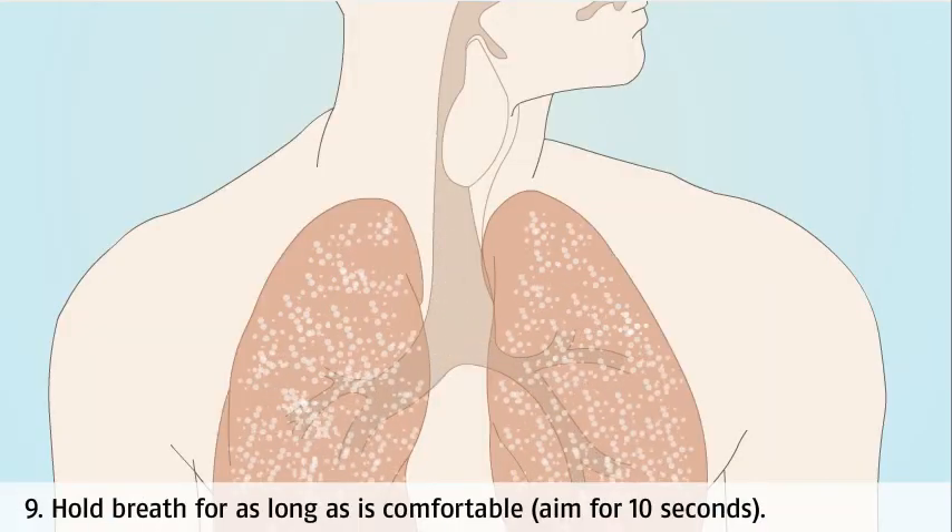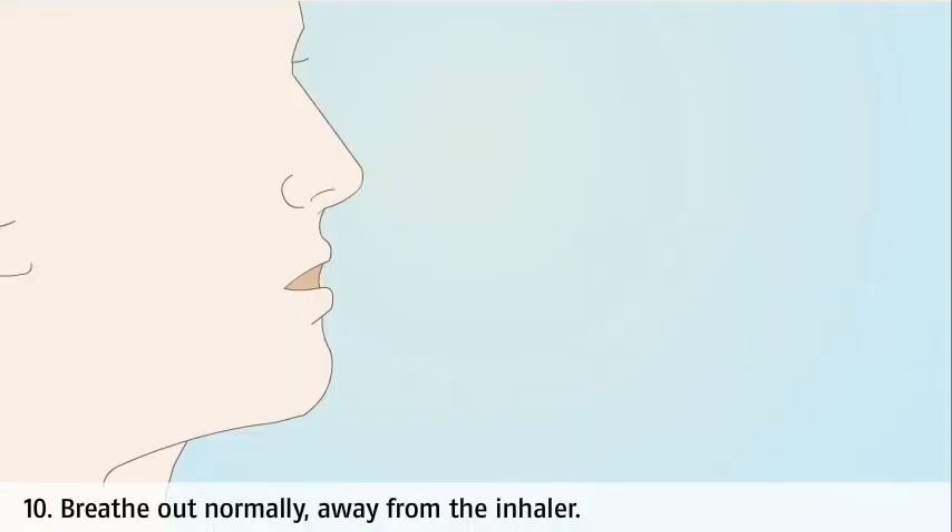Hold your breath for as long as is comfortable — aim for around 10 seconds. Breathe out normally away from the inhaler.